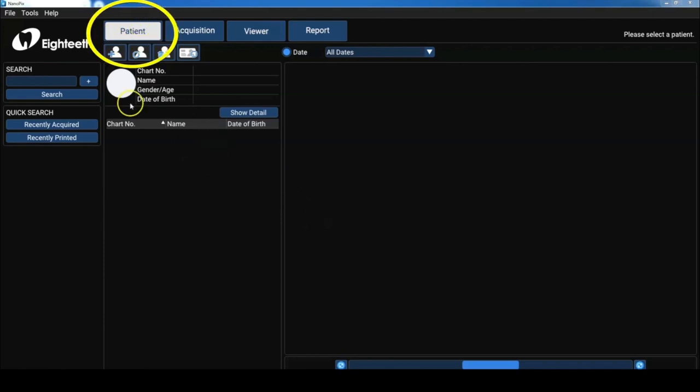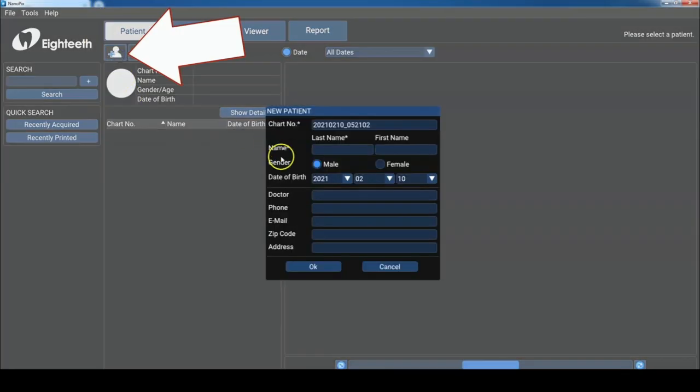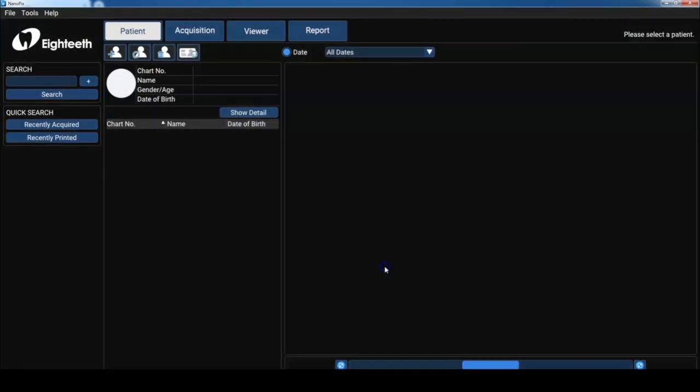We can create a new patient by clicking here and enter the patient details as necessary. So let's take a look at my case. I have a root canal.